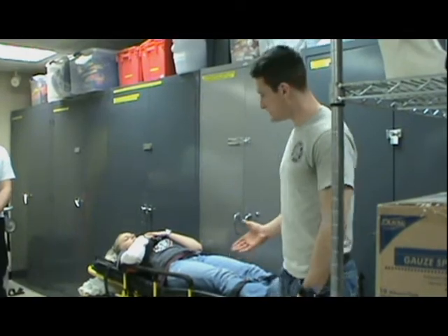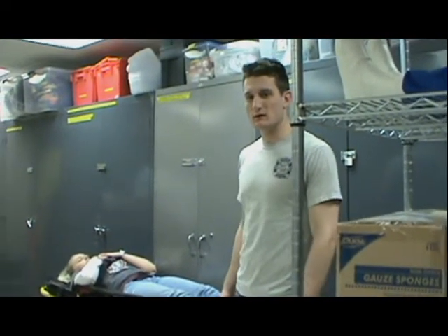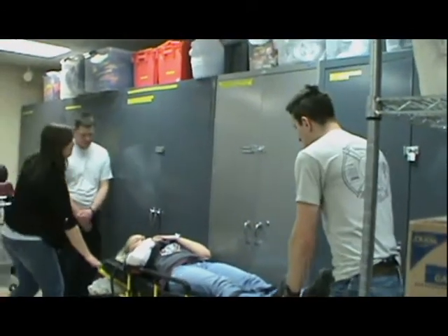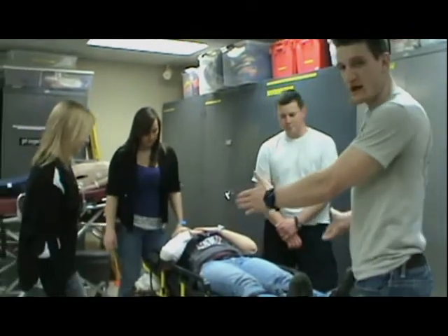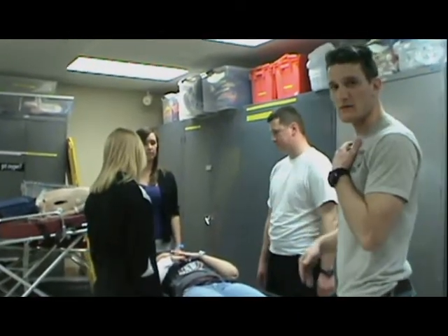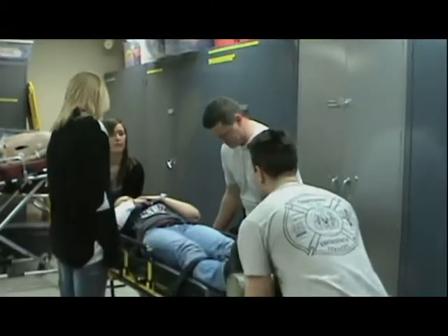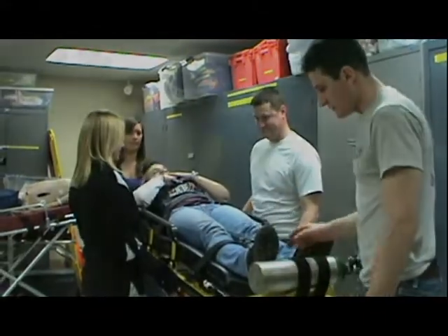We're going to demonstrate picking her up, and then we'll be done with this demonstration. Let's move her out — we'll have four people: my two firefighters on each side, and the attendant and the partner always at the head and the feet. Up on three: one, two, three. And now we're good.